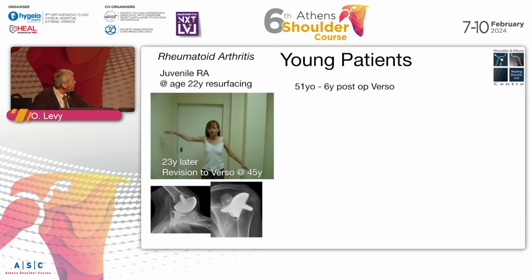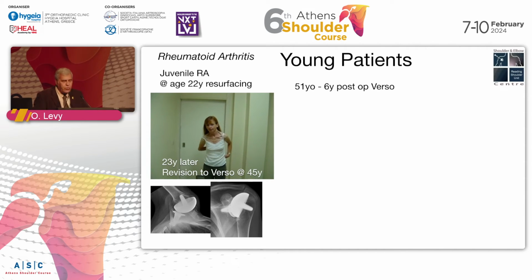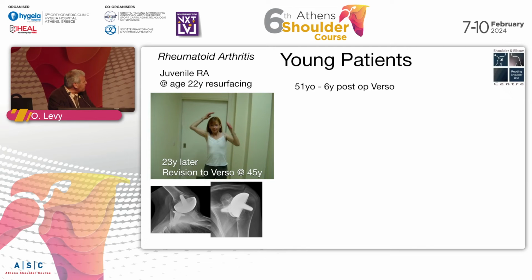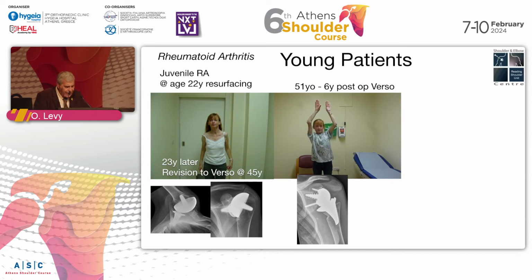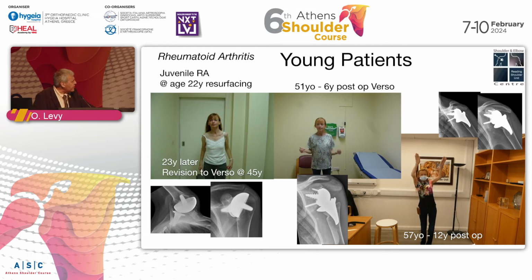This young lady, at the age of 22, was operated by Steve Copeland, and I think she was the youngest patient he did with a total resurfacing due to juvenile rheumatoid arthritis. This is 23 years later. She's 45 years old here, and she lost the rotator cuff, as you can see, and as happens with rheumatoids. I revised her to a Verso. This is 6 years after the revision. She's only 51 years old here, and here, this is 12 years after the revision. She is only 57 years old, and she's got the best function she ever had, and if anything goes wrong, I don't know if this will last for the rest of her life, I can still do something because I've got all the bone there.